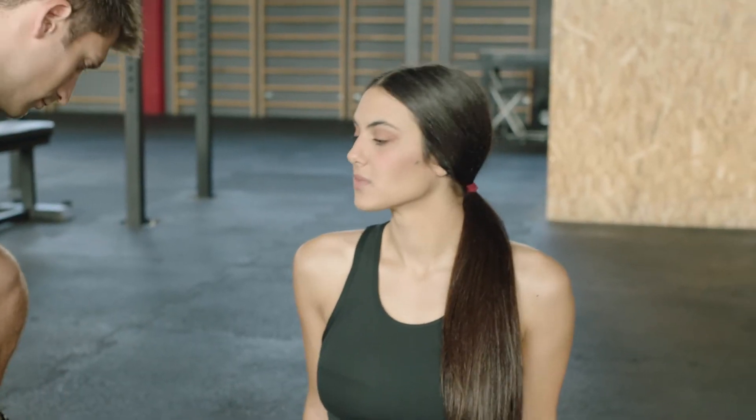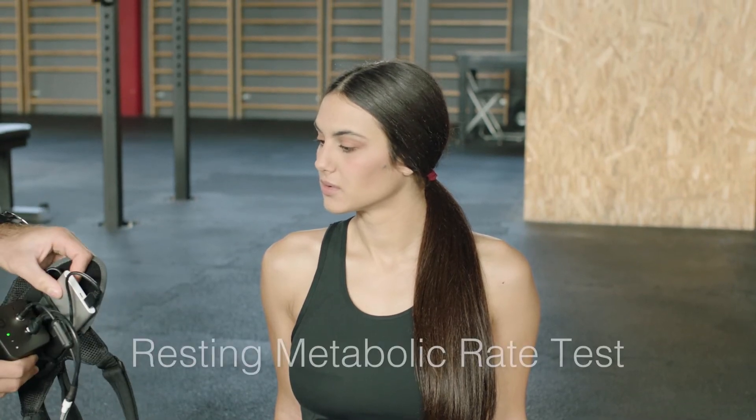Once you have calibrated the device, you can conduct an RMR protocol. Make sure the yellow light on the device is blinking and the white lights of the power bank are blinking as well.